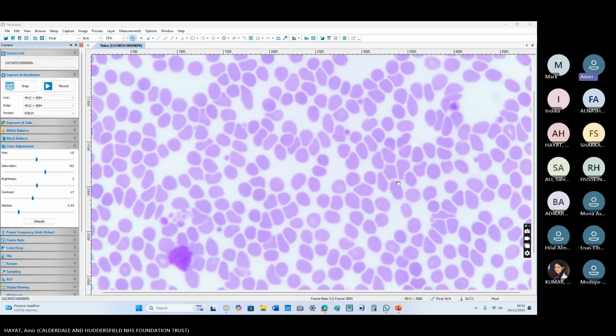different shapes. Like this is called stacking of red blood cells. Like you are keeping bricks on the top of one another. So they have different side shapes. Some are straight, some are regular, round one, because the mass is very high and they are compressed together.